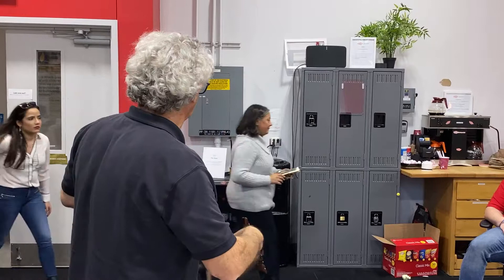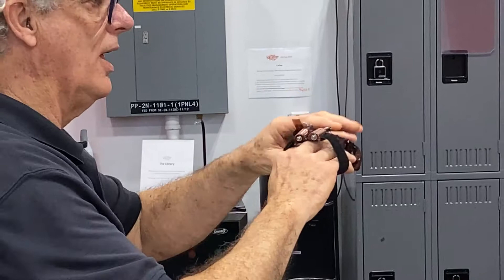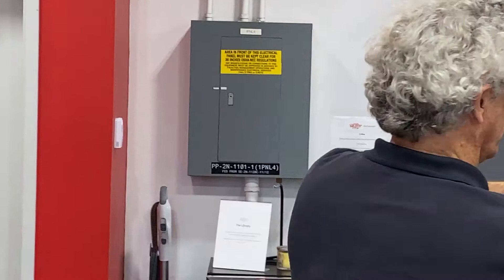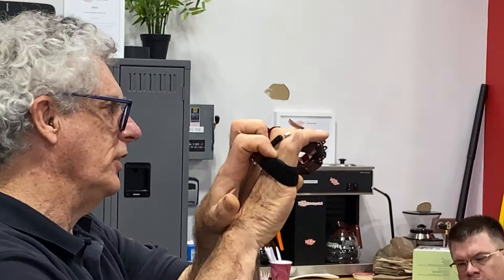The idea of this is that these end pieces fit over his stumps. Once that happens, this can be adjusted to fit his hand here, or his arm here, anywhere. When he closes his fingers, these close just by the action of moving his fingers, requiring no mechanical anything except the tendon.